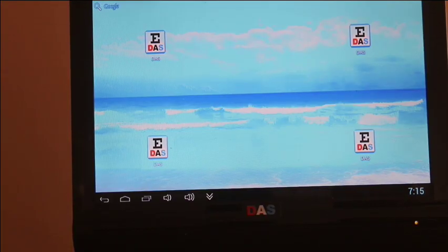This is the opening screen of the digital acuity system. To open the DAS application, we hit enter on the remote control, and we then click on the application. It then takes us directly to the last screen that we were on. In this case it was Snellen. And we scroll down with the buttons.